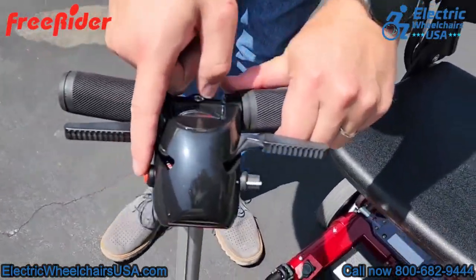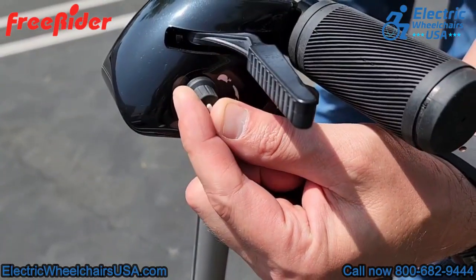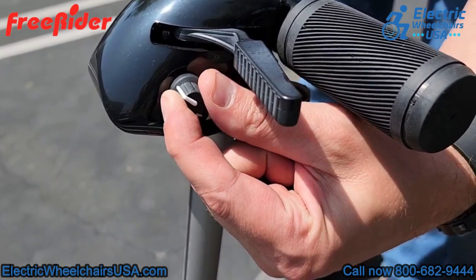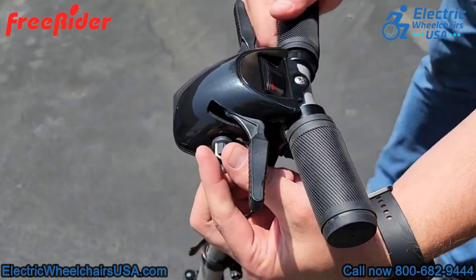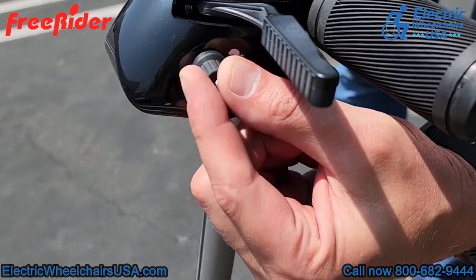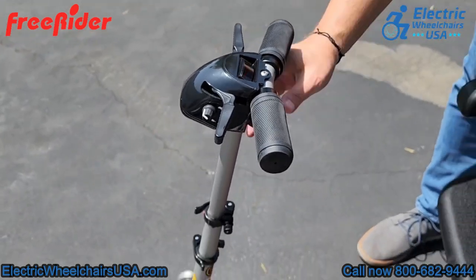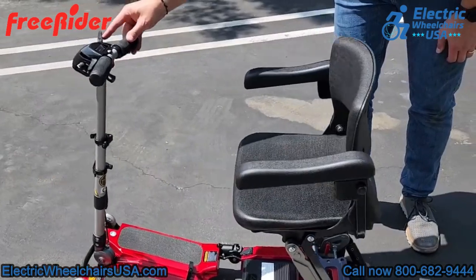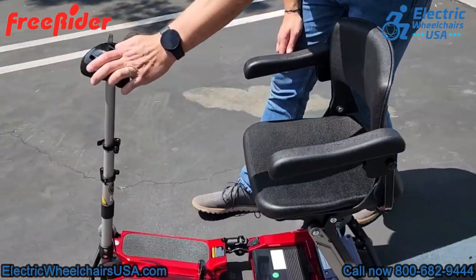On the tiller, this red button is your horn. On the left side is your battery gauge. This is your speed control dial — if you turn it all the way to the rabbit you can achieve the top speed of four miles per hour when you fully accelerate, but you can also turn that top speed down for riding in crowds or in a store. This button is your on/off switch. The throttle is ambidextrous, so you can accelerate forward or backwards with just one hand — if you have limited mobility in one hand, that's not a problem.